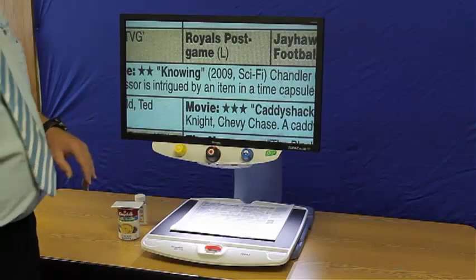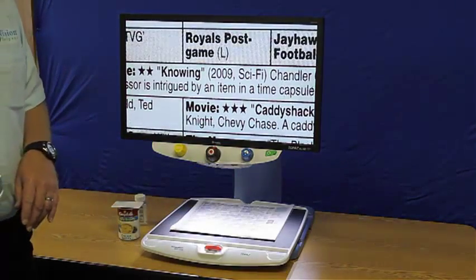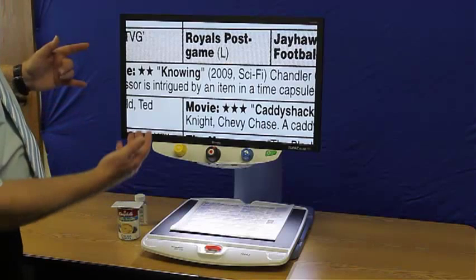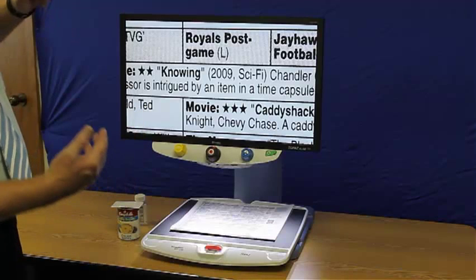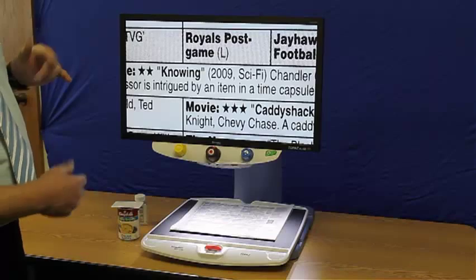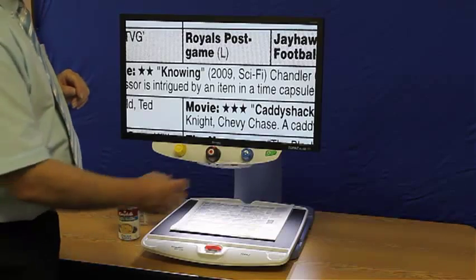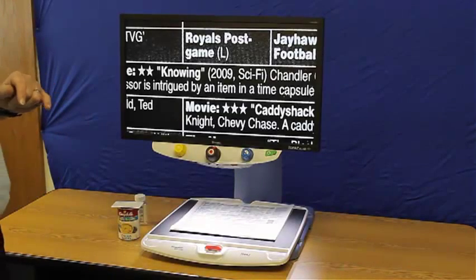To the right, we have a blue knob that controls the different modes. Right now we are in color. If I turn it one notch, we have what we call a high contrast black and white. As you notice, everything there is either black or white, and it gets rid of the grays that you might see, so it makes it a lot easier to see. We turn it again, we get the negative, the high contrast negative.